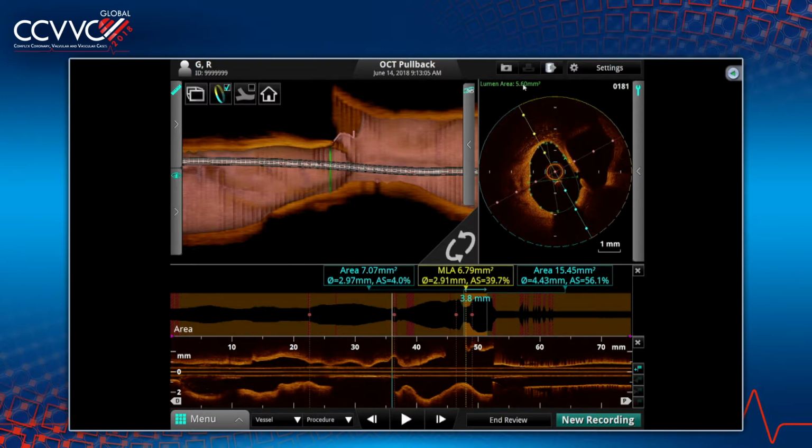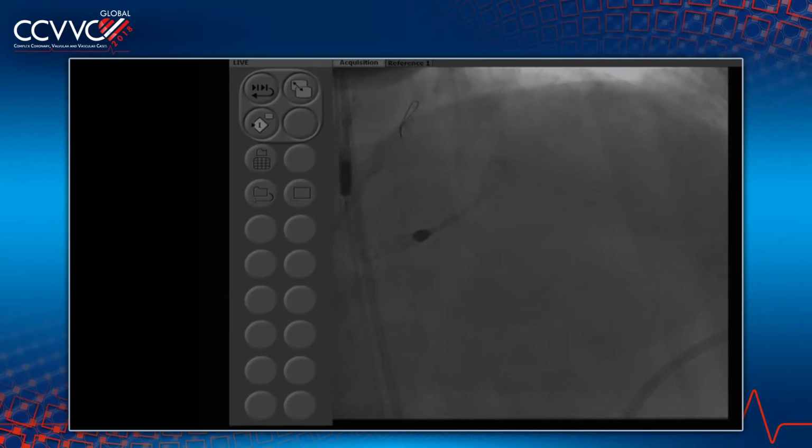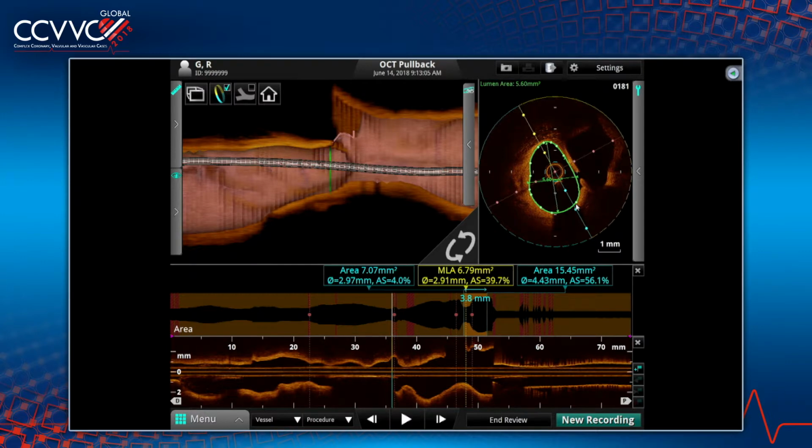Well, I think everybody just wanted one brief comment on what he just said. Dr. Grube? And we all laughed about it. It looks fancy. When you have these imaging techniques, you all have to ask yourself, what does it really mean, and what can we take out of it? Does it change anything, or is it just fancy to look at? That's right. And I think that's very important to see how you are incorporating what you're seeing on OCT as opposed to the patient's symptoms and everything else.